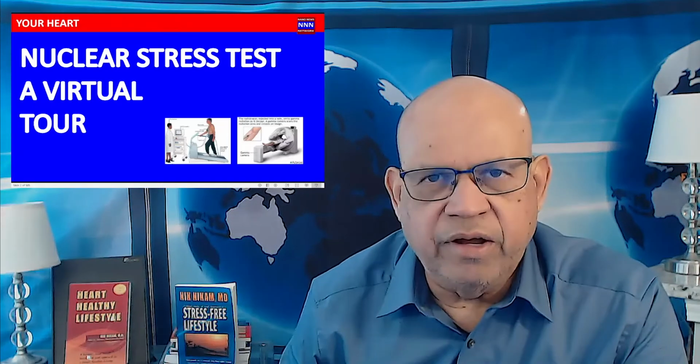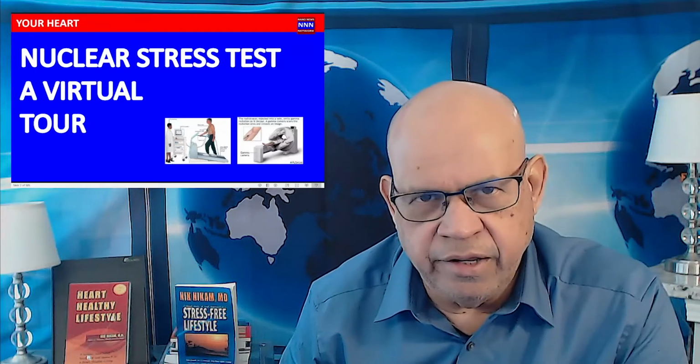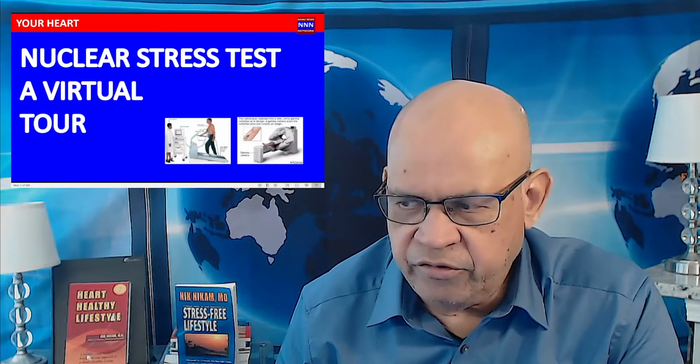The feature presentation is a nuclear stress test, a virtual tour. If you have been ordered a nuclear stress test, I'm going to walk you through exactly what are the things that you need to focus upon, what is going to happen in the laboratory, and how we process the images and how we interpret the results and make a decision. So let us take this virtual tour.